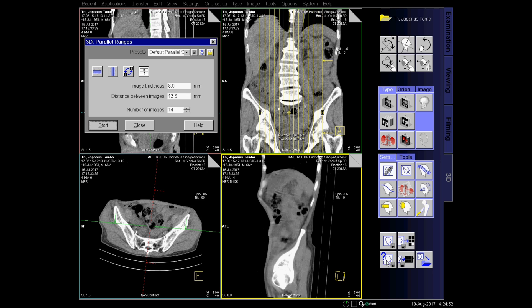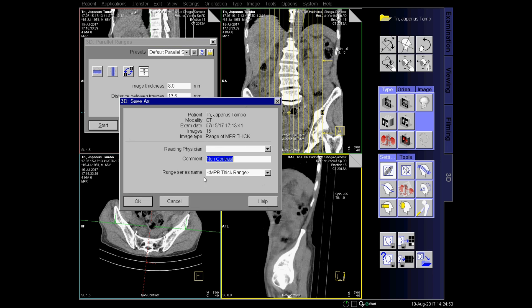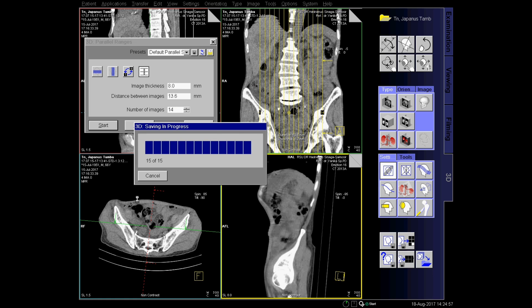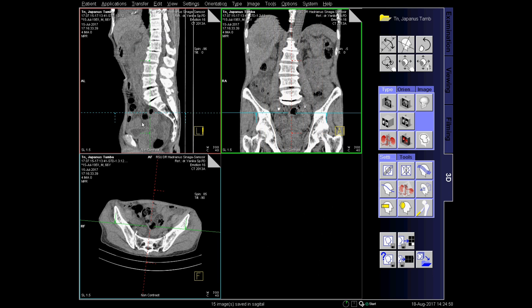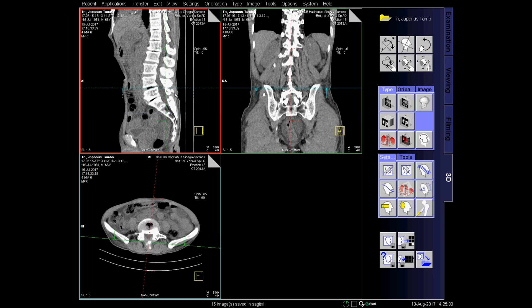We start to process the image fragments until it matches the parameters we have set. Then save it and don't forget to name it — sagittal set.